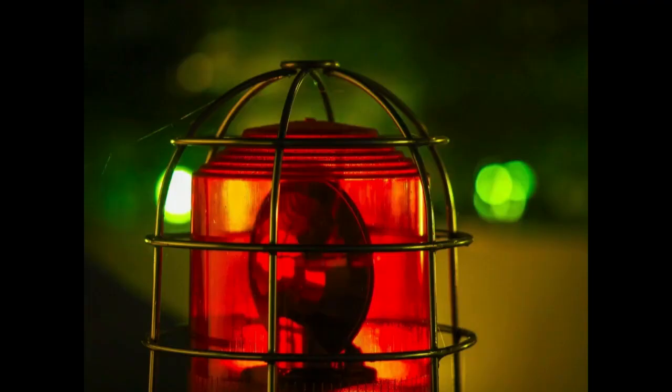So step 1. When you hear the alarm go off in your emergency department, walk towards the alarm. This alone is going to set you apart from everybody else in your department who rapidly finds something to do elsewhere or is rapidly busy in some other area of the department. So it's a hero move just right there to walk towards the room because nobody else will be doing that. I love the picture selection because there are cobwebs over that alarm. Nobody goes near the alarms, man.